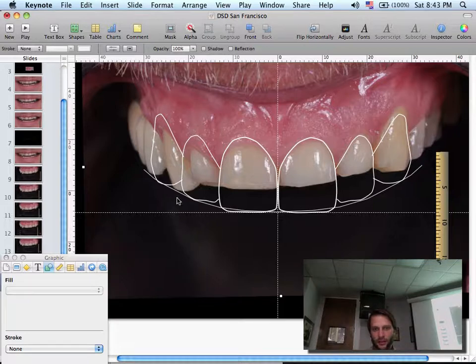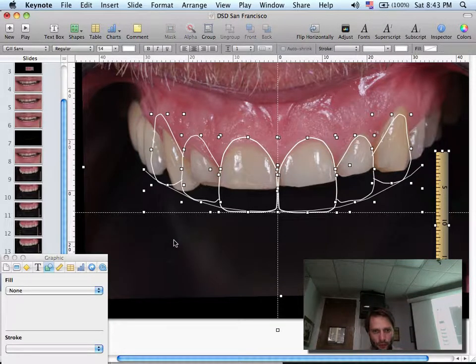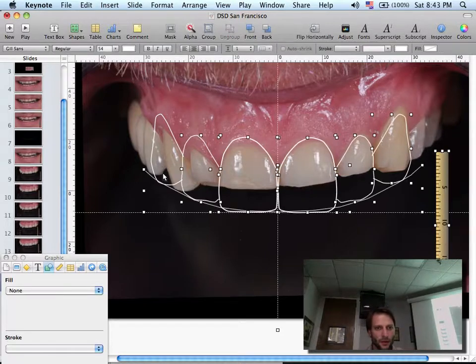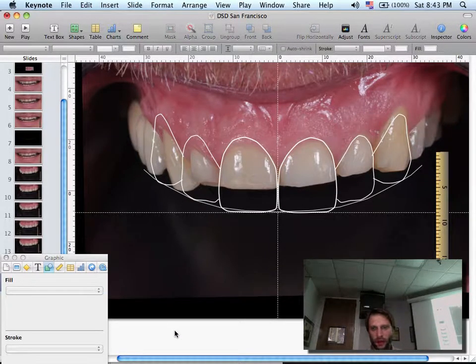The only detail here, look at the cuspid. If we look just at the cuspid, look what I have to prep. I don't have to prep the buccal at all, but I have to prep a lot the incisal lingual to allow me to create and to move this incisal edge buccally. So this is the information that we can get from this area over here.